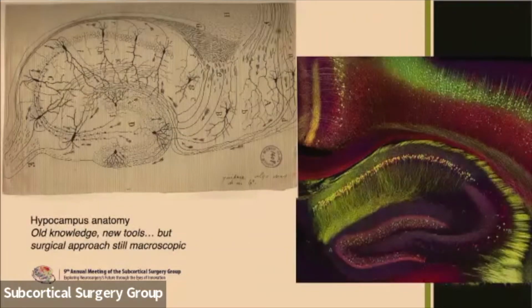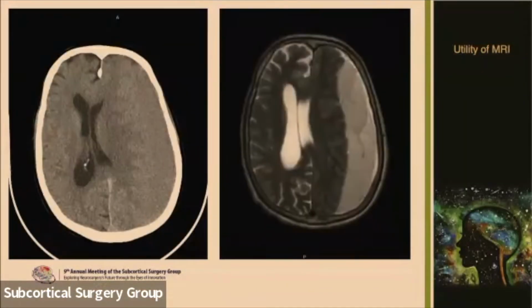And we know there is great multi-shell MRI out there, and we know that there is fantastic understanding of histopathology, but how do you make that happen in every case, in every clinic all around the country? And one path, I think, is improved imaging. Many of us are comfortable taking out that subdural based just on the CT, but it is really nice information if you get an MRI, even though it is the simplest case in neurosurgery. Having that additional information, to me, is good. It's interesting. It helps my planning.